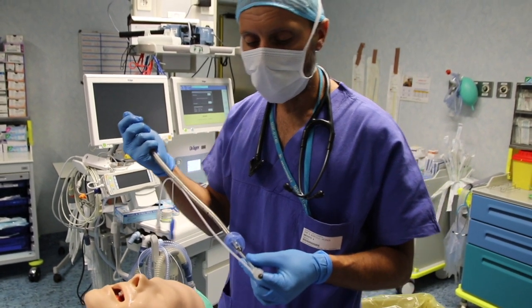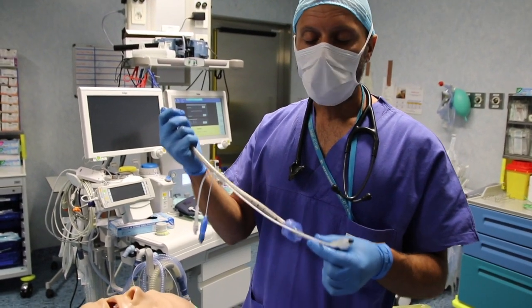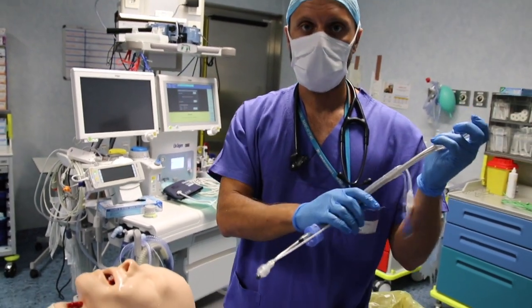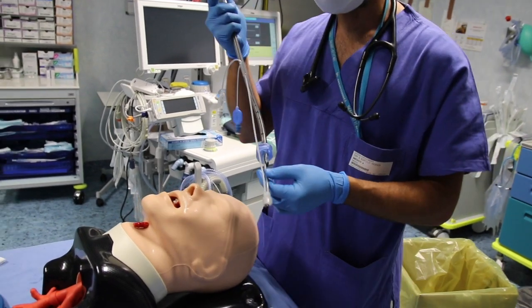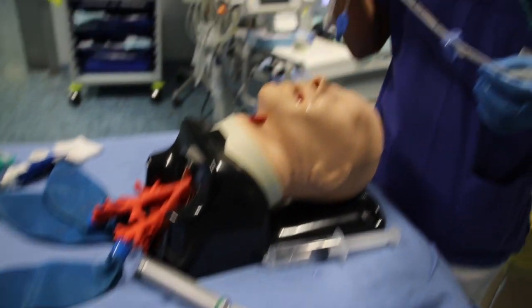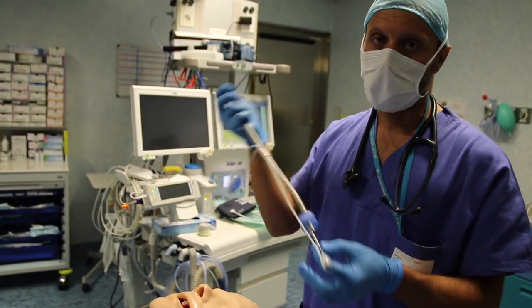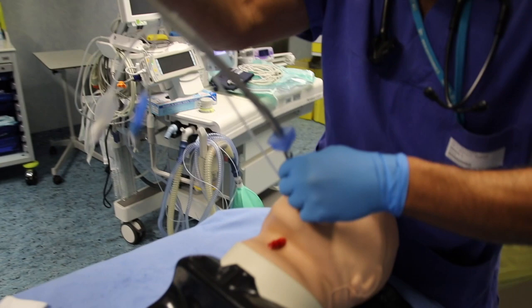Once the integrity of the device has been checked, it can be inserted using your right hand or your left hand, as you prefer, through the patient's mouth, in a blind way or with the help of a laryngoscope, as we'll show you in the next episode. To perform the blind insertion, follow the retromolar way, left or right.